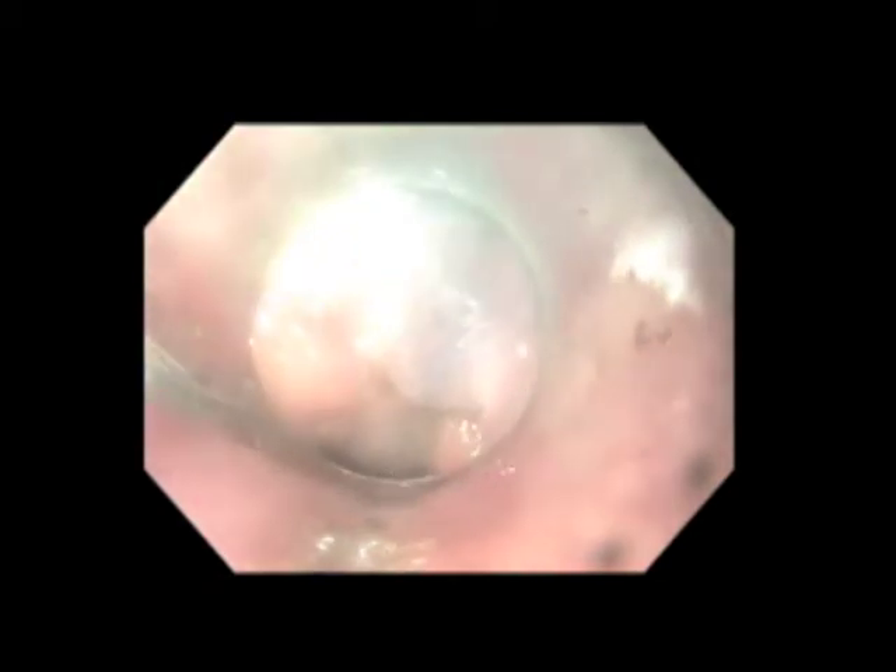After the tunnel is believed to be at least three centimeters past the EGJ and onto the stomach, we remove the scope from the tunnel, pass it through the true lumen and into the stomach, and retroflex. On retroflex view, we should be able to see blue dye past the EGJ through the gastric submucosa as discoloration, which we can see here. This confirms that our tunnel has an adequate length onto the stomach.